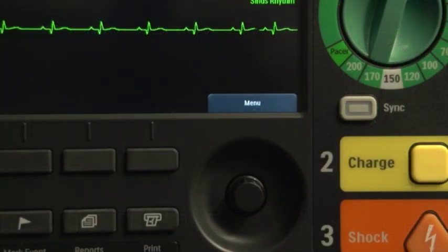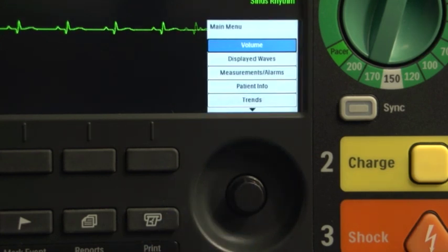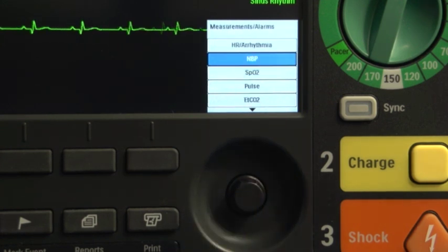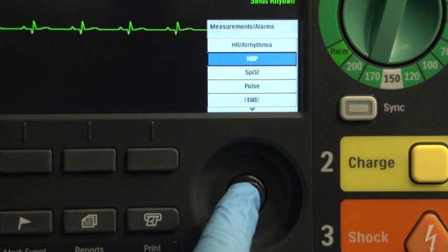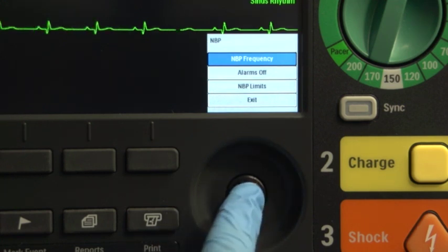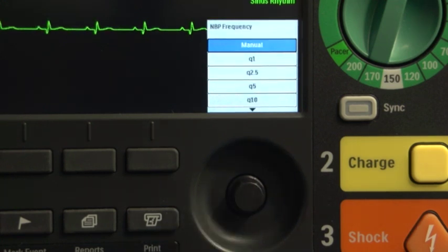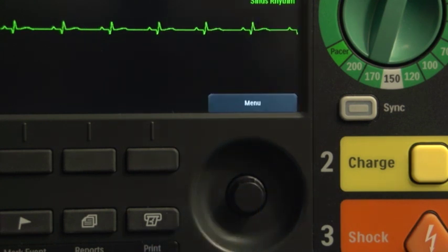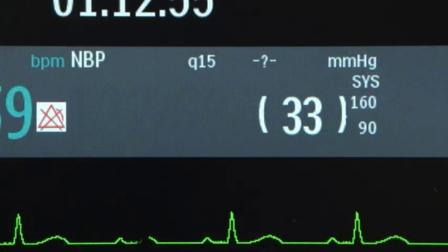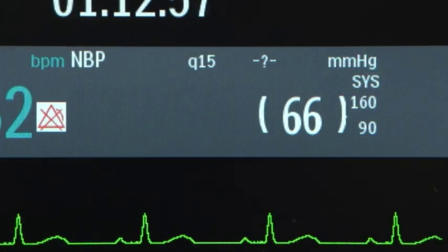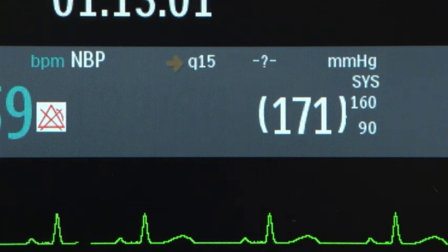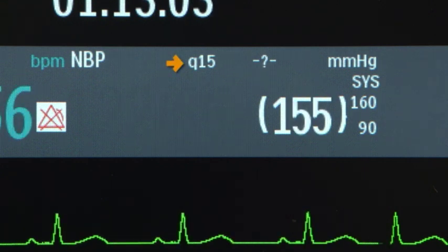To schedule automatic NBP readings at regular intervals, press the Smart Select knob. Navigate to Measurements Alarms, NBP, NBP Frequency, and press the Smart Select knob. Select the desired interval and press the Smart Select knob again. Automatic measurements begin based on the interval set, and the automatic time interval appears on the screen.